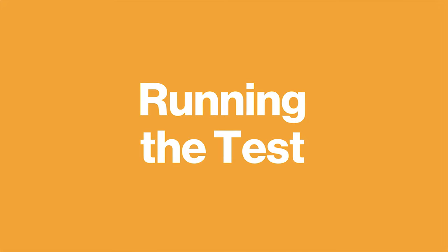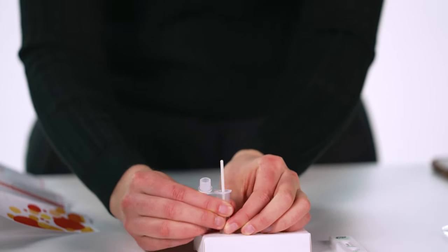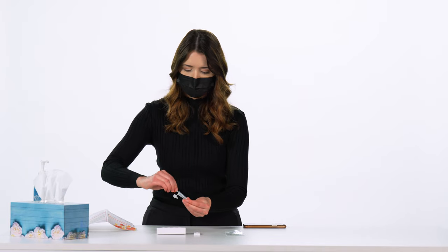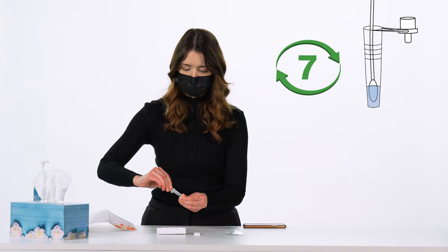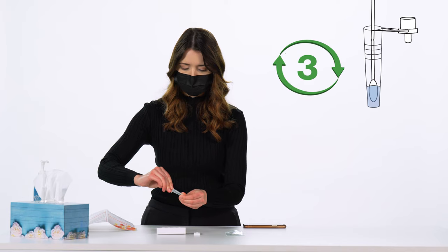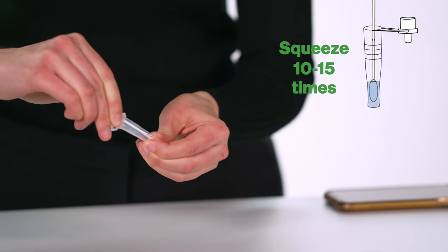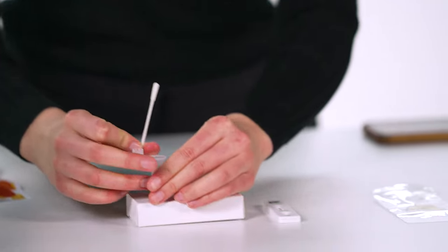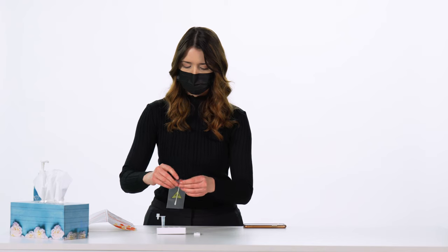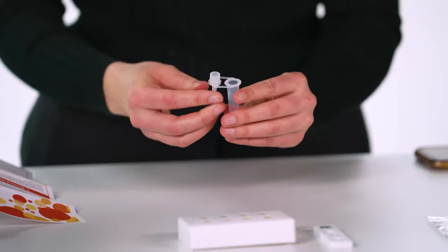Running the test. You are now ready to process the sample. Place the swab with the sample into the liquid inside the extraction buffer tube. Swirl the swab, rotating it for at least 10 seconds to mix the sample well. Squeeze the swab 10 to 15 times by pinching the sides of the tube against the swab while rotating it. Remove the swab while squeezing the tube to release as much liquid from the swab as possible. Dispose of the used swab in the plastic waste bag provided in the kit.